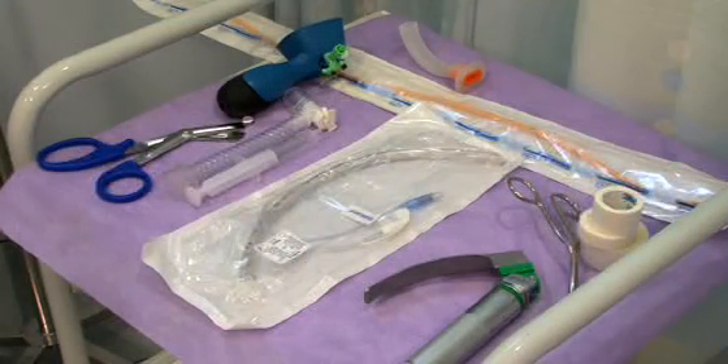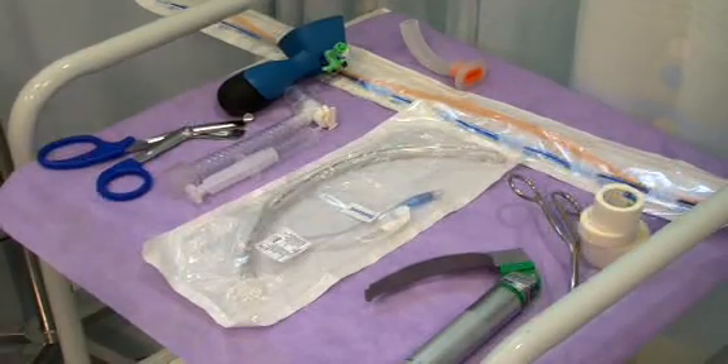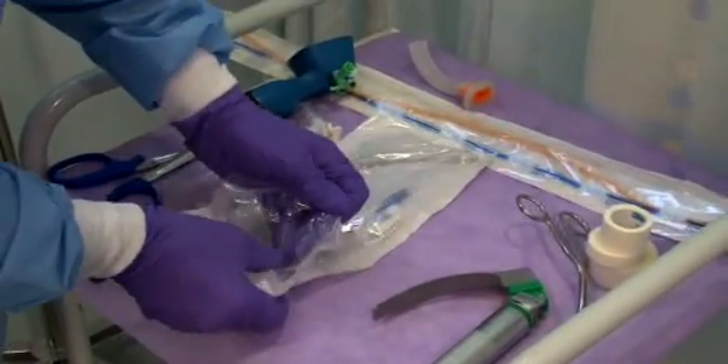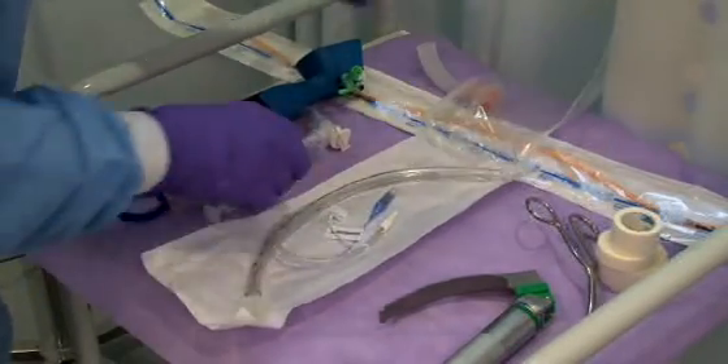Ensure that the trolley is fully prepped in accordance with your hospital's infection control policy, and that emergency airway equipment is available close by. All Mallinckrodt SealGuard tubes are sterile packed for single patient use and can be used in position for up to 29 days.